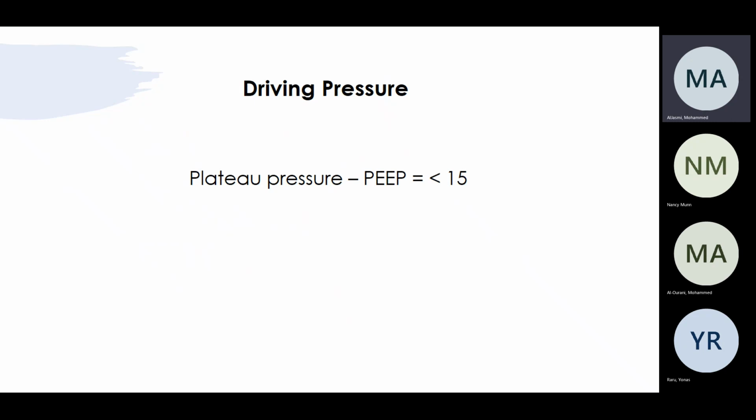So when I go up on PEEP, the pressure should go up at the beginning because the machine will not give the same volume. Then you give it at least a few minutes and come back. If from the beginning it goes up 2 in the PEEP and 2 in the plateau, there's something wrong going on. Maybe I'm just stressing the same alveoli, but give it a little bit of time. I'm not in the range of barotrauma, is that right? Give a little bit of time and see if that's okay or not. I can recruit, I'm still safe, is that right?